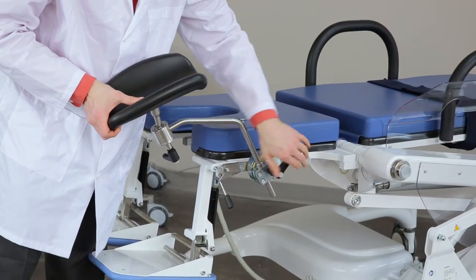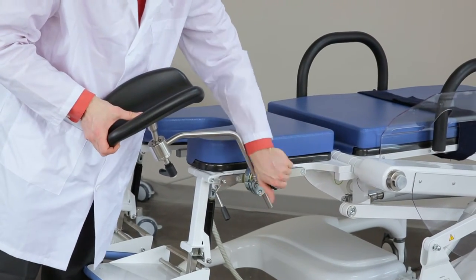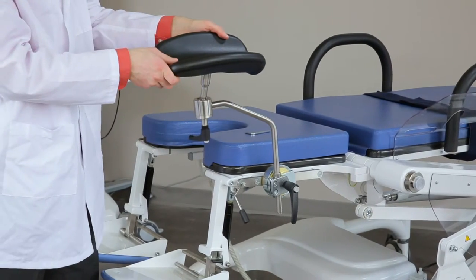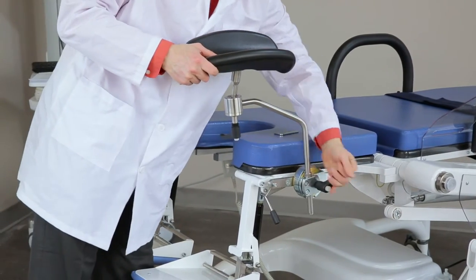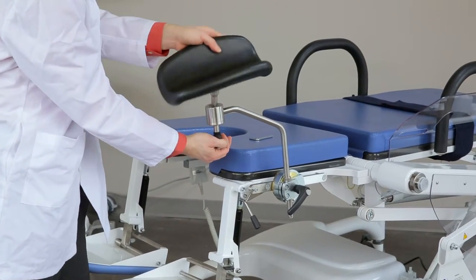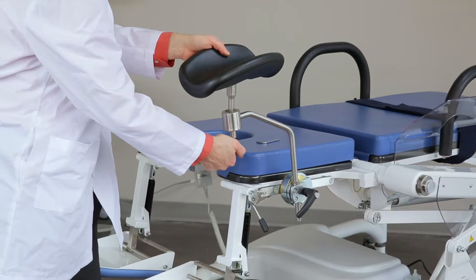Rotate the handle on the leg rest holder counter-clockwise to loosen it. Adjust the height and placement to your preference, and then rotate the handle on the leg rest holder clockwise to secure it again. You can adjust the angle of the leg rest pads with the swivel directly underneath it.